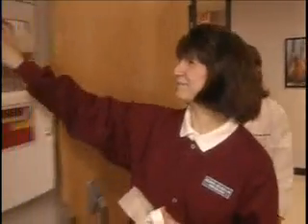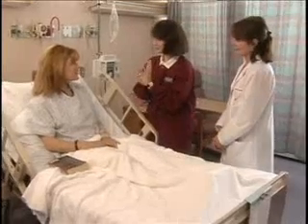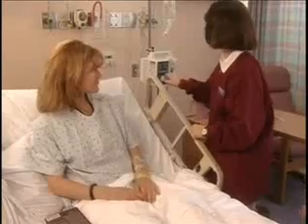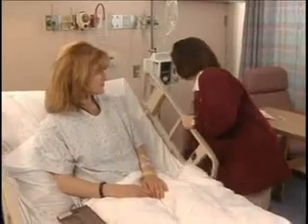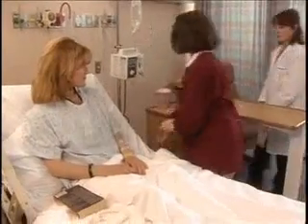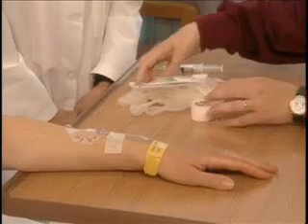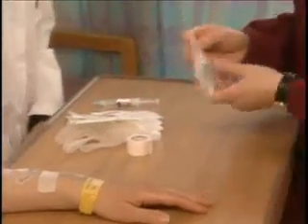Mrs. Spot, hi, you're doing great. So good, in fact, that we're here to disconnect your intravenous infusion. Oh, that's good news. I just need to check your ID band. Can you tell me your full name, please? Carla Spot. Let's put your arm right up on the table. We're going to attach short extension tubing to the IV catheter, so let's prime the extension tubing with normal saline, Jeannie.